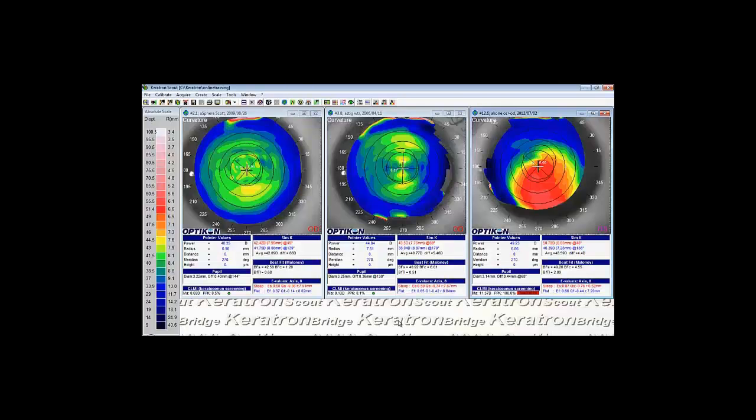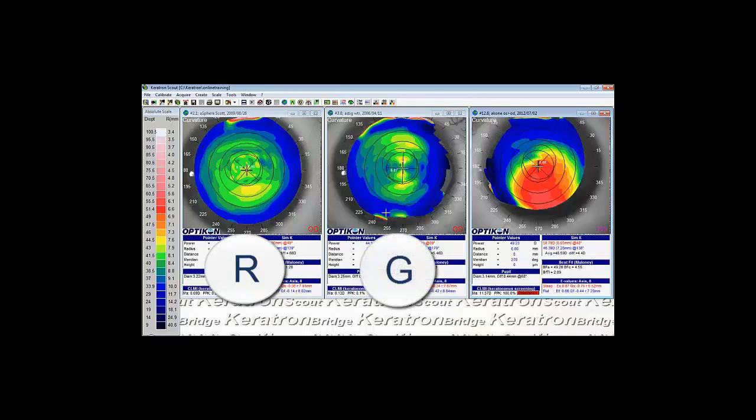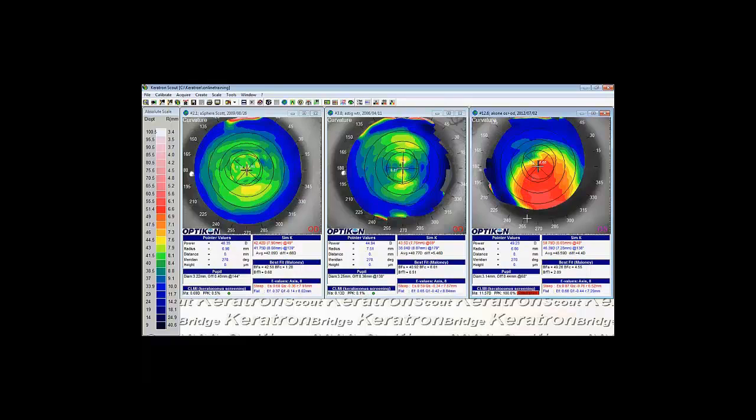Here I have three topographies up. Notice the one on the left is a fairly symmetric cornea. This would be a good decision for an RSYM lens. The one in the middle is pretty classic with the rule astigmatism. This would be a good choice for a G-SYM design. And the one all the way on the right is keratoconus. You'll notice this cornea is asymmetric, so this would be a good decision for a Freeform style lens.